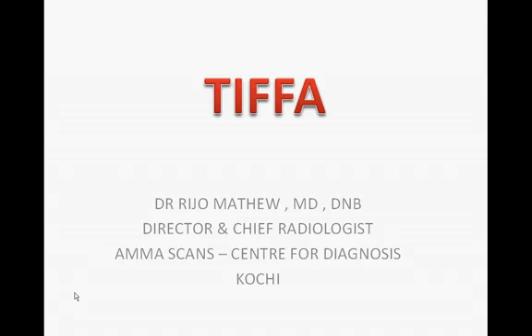Today we are going to talk on the subject TIFFA, T-I-F-F-A. And what do you mean by TIFFA scan?